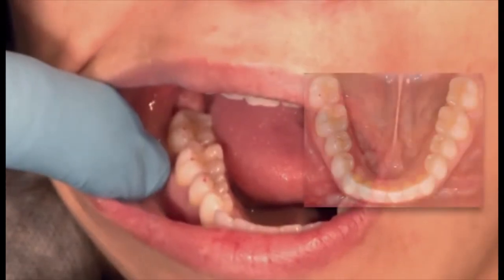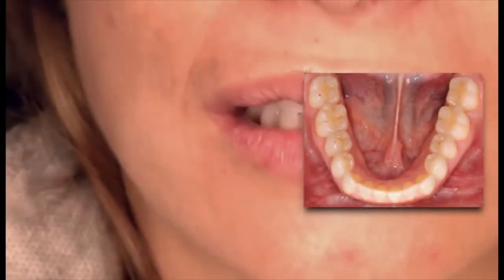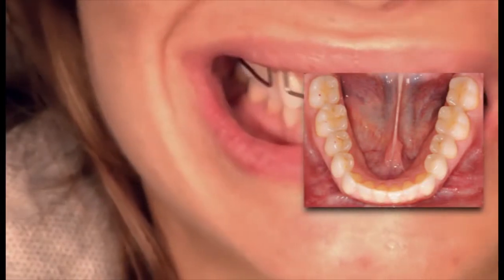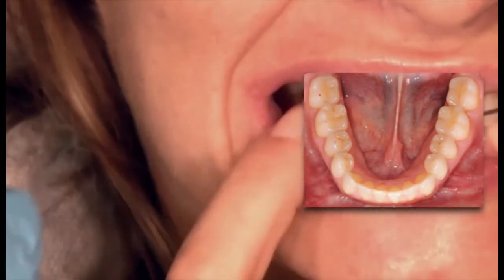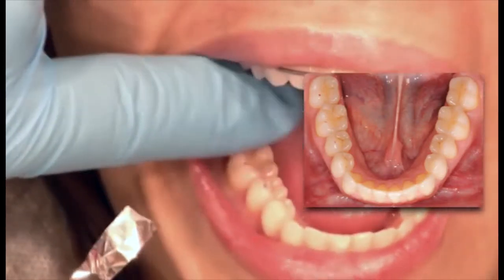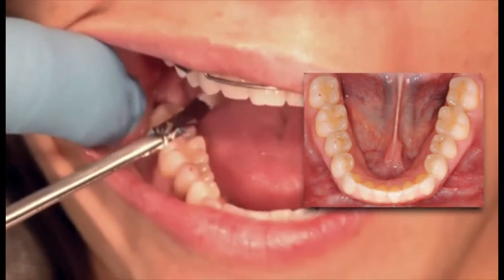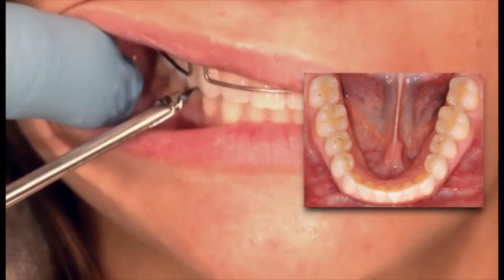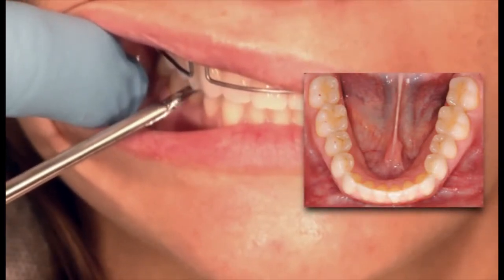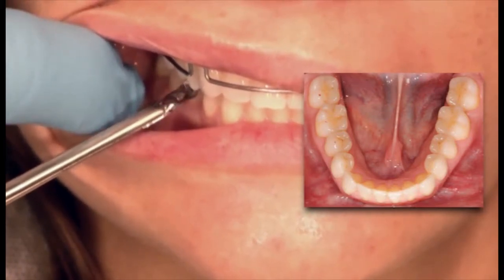So if you take a look at the contacts, can you tell which tooth appears to hit the most? No. All right. Right in that region. Whenever the patient starts to point to a tooth, I like to take shim stock, close down, and see if they're right. And this actually does hold. So it's exactly where she said it was holding.